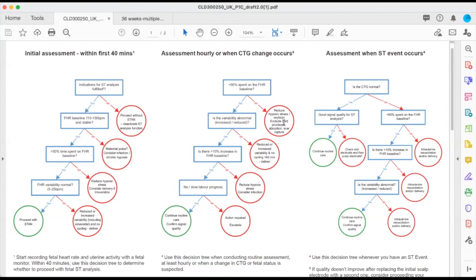Okay. So quick question. The question is about contact. How long or how many checks do we need for STAN to be doing for us to be reassured by the baby's status? Do you need 4 crosses and 10? No, 4 crosses and something. I can't remember. So ignore the rules. Let's make this up as we go.